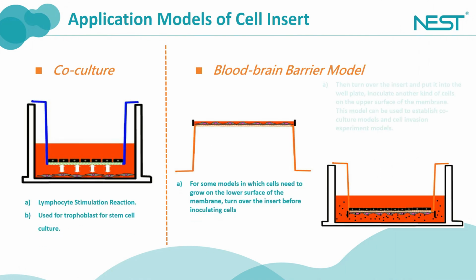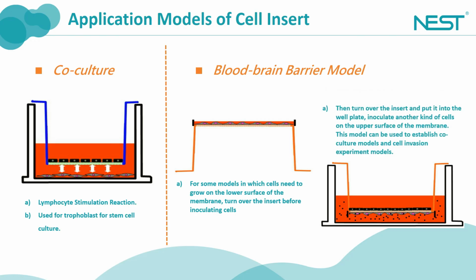Next, we will learn about another application model, co-culture. Inoculate cells in the upper and lower chambers of the cell insert, respectively, for co-culture. The common applications of this model of co-culture include lymphocyte stimulation reactions and trophoblast culture of stem cell culture.